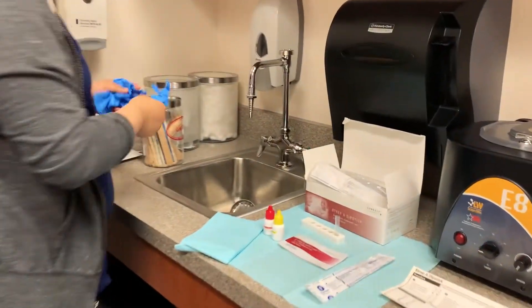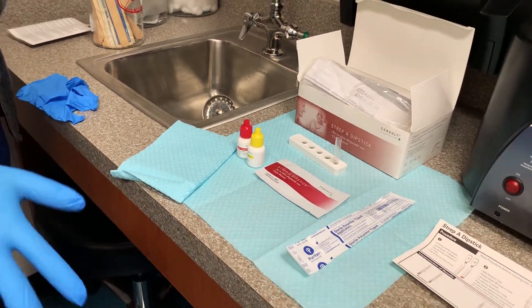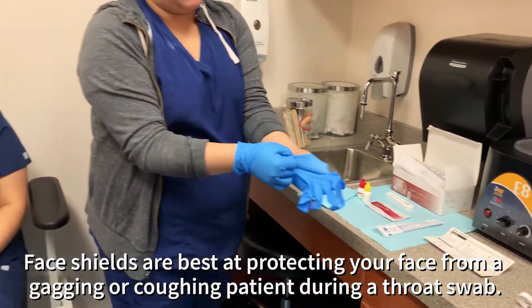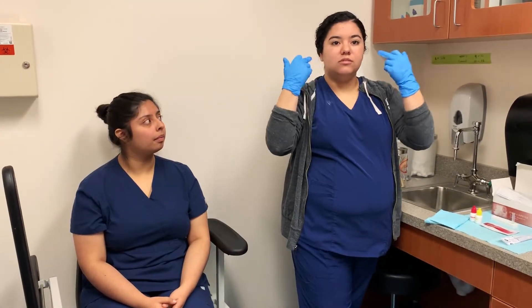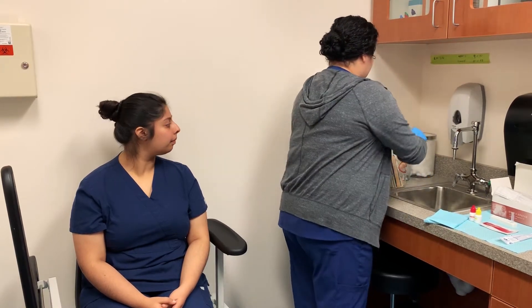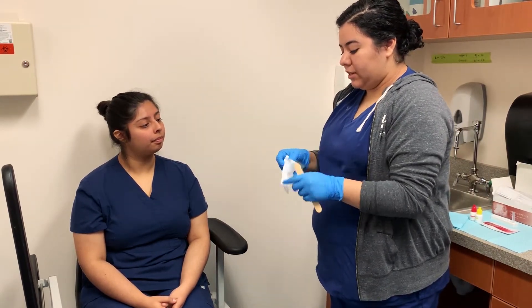All we need is the tongue depressor. For this test, I usually wear a mask to protect myself from the patient just in case they cough. Patients will gag for this test because you are going to be touching the tonsils — you are going to be rubbing the swab against their tonsils. I already verified my patient and I already let them know what I'm going to be doing and how I'm going to be doing it.